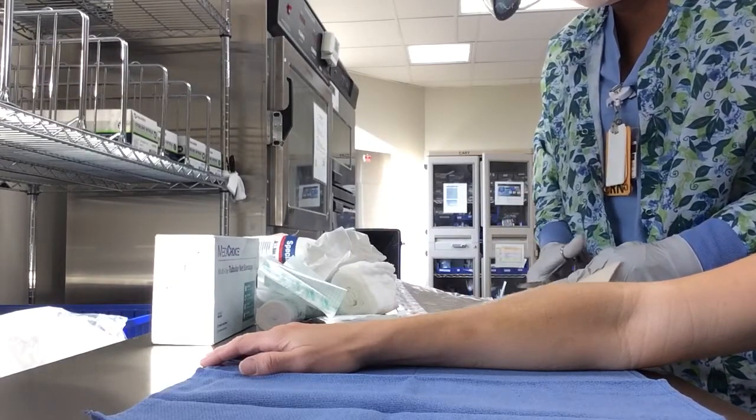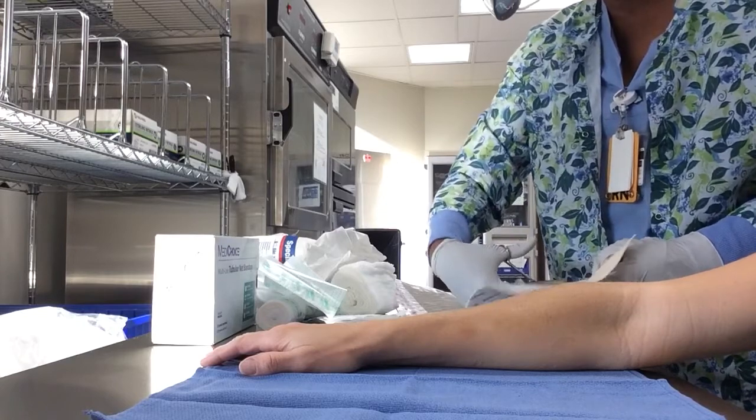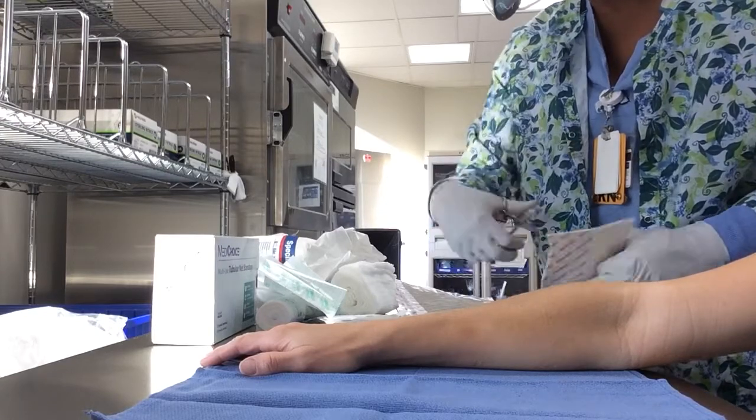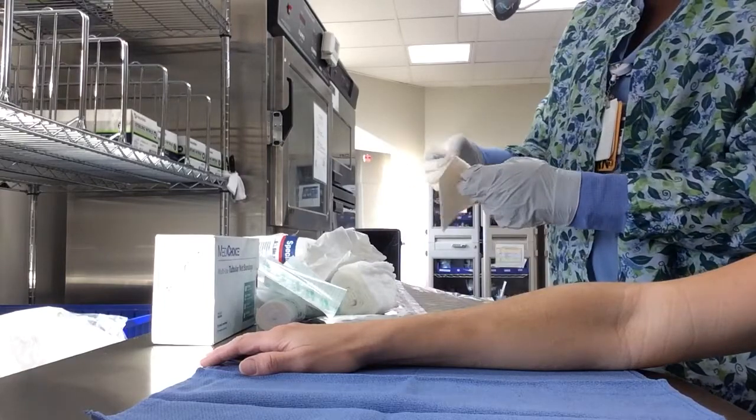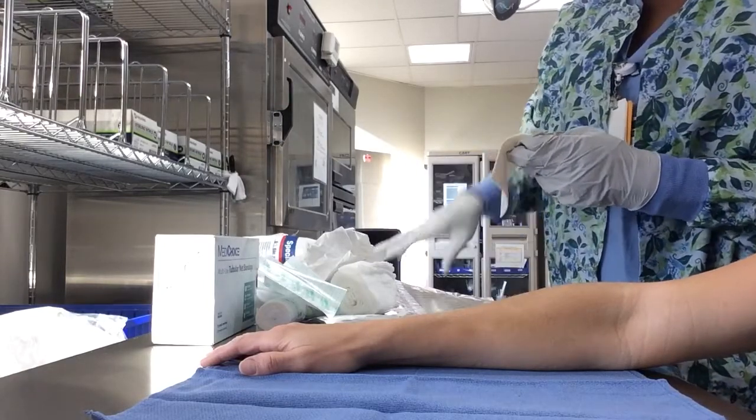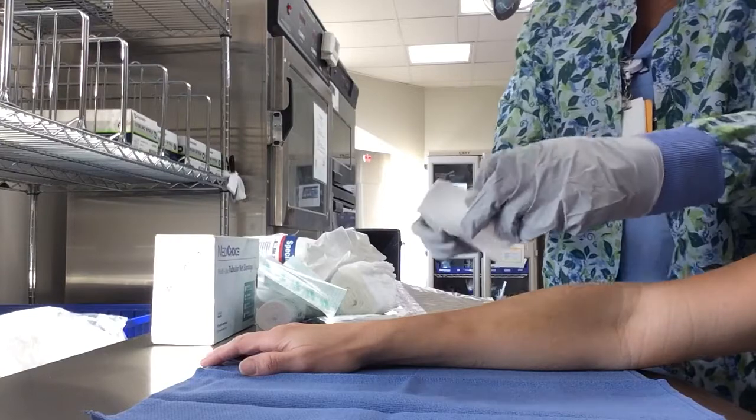You will place it on the patient like so. Take the backing off, and the sticky side goes on the patient like so.